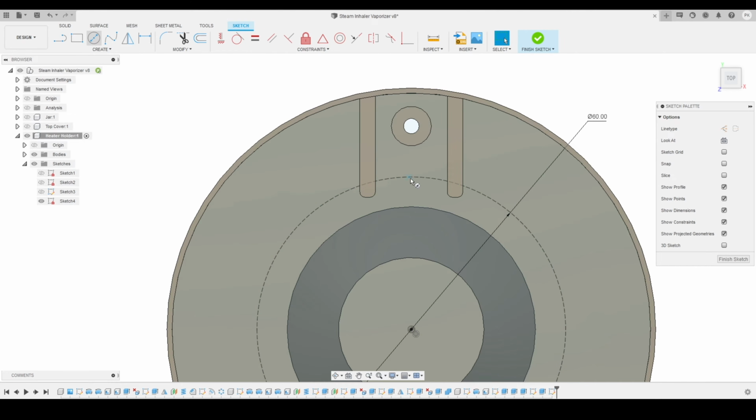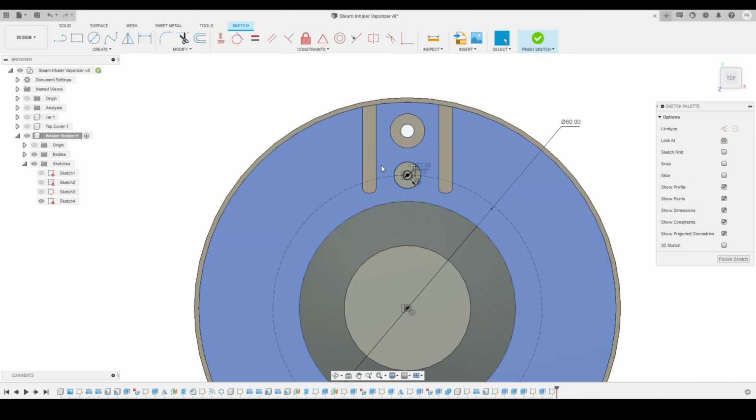Then I will create one more circle somewhere here, and I will make sure that the origin of the circle and the main circle are on the same vertical position. After that I will define the diameter of this circle. So this one I just want to keep 2 millimeter, and I will offset this circle by a distance of 4 millimeter. I think 4 is bigger, so I will just make it 2. Here you can see. And now what I will do, I will just select both the circles. Before that I will just click on finish sketch.